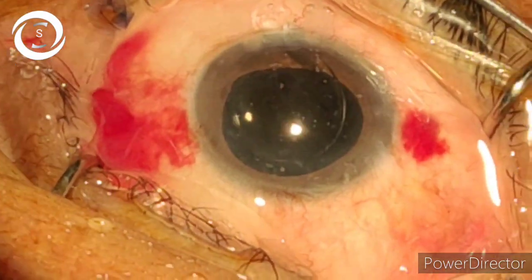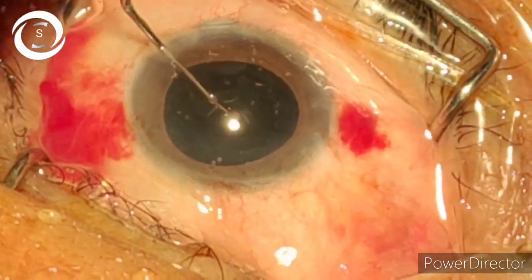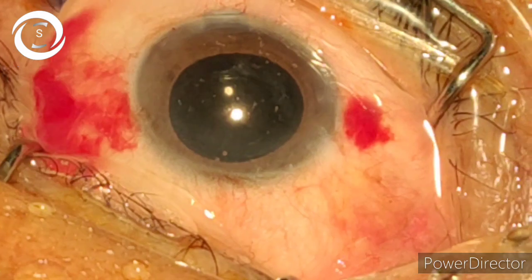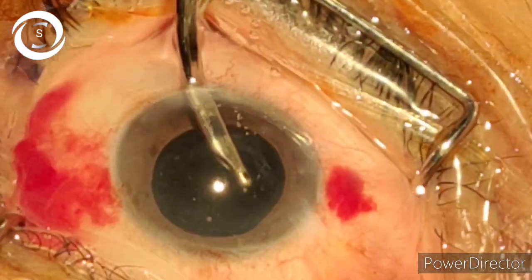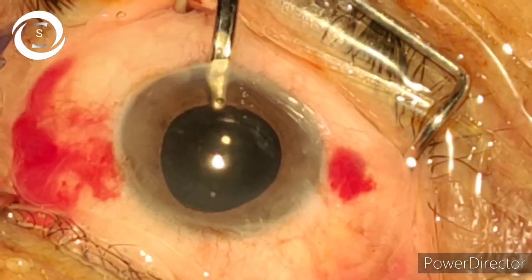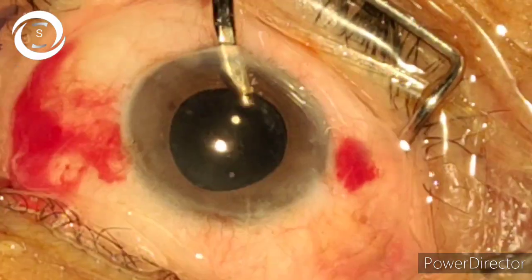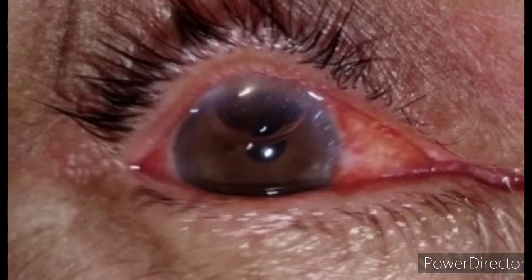We have removed the cortical sheets and now we have inserted the foldable IOL. I hope that in this video I have shown you my modified tilt, rotate and chop technique, and if you apply this you will almost eliminate the chances of PCR. That's the first post-op picture and you can see that the cornea is shining, even though we have done anterior phaco. Thank you very much.